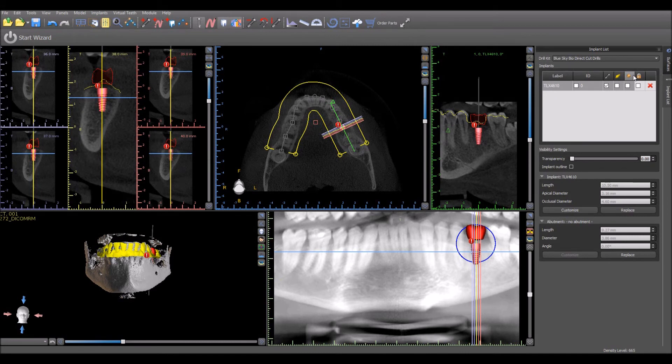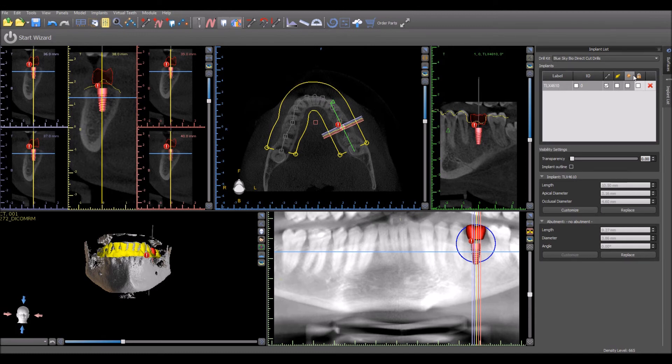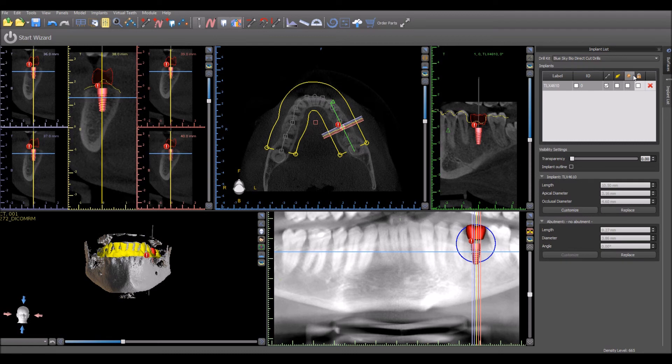In addition, the BlueSkyBio kits will also appear as they can be used as universal kits to create the osteotomy hole based on the implant apical diameter, and then the implant manufacturer's drill should be used to create the final osteotomy size.